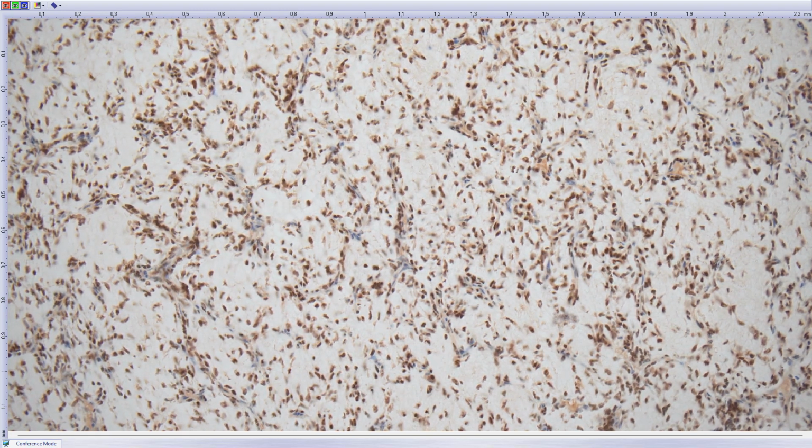But still, we are in the retroperitoneum, so this is a metastatic myxoid liposarcoma, and the original tumor was somewhere on a distal extremity. They sent it for consultation with the correct diagnosis, but they were not able to confirm the rearrangement using FISH studies. Probably they had some technical difficulties. So nowadays we use only this immuno and very seldom molecular genetics. So my second case is metastatic myxoid liposarcoma in the retroperitoneal space.